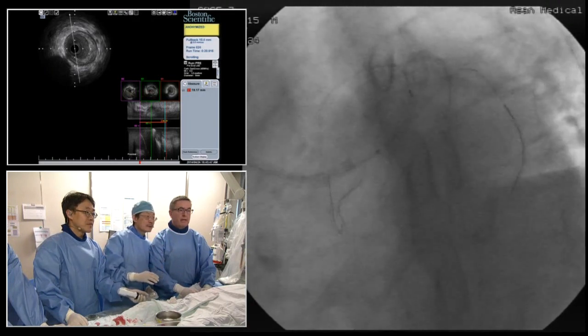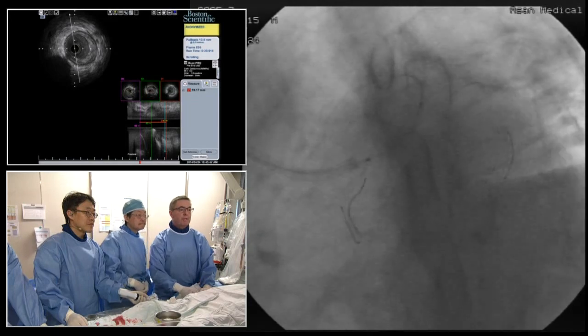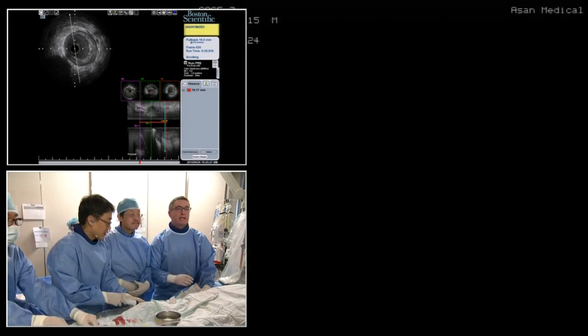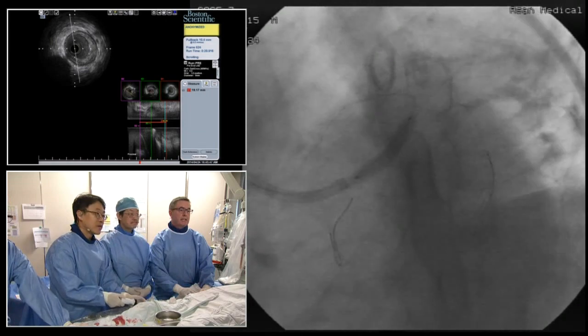Yeah, I'll just pull back. Now, I'm not too concerned about trapping the wires here, so we'll only go to 12 atmospheres here. You ready? We've just pulled back inside the stent. Now this is 3.5, so it's bigger than the lumen, but right for the vessel size distally.